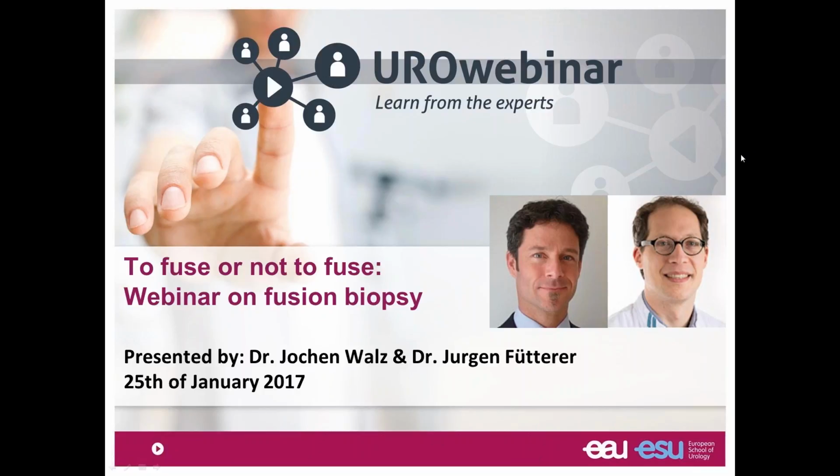And the question, of course, is of special importance and interest for active surveillance, where we might do repeat MRs at a certain time point just to see if lesions that you might see did change over time, and to organize new biopsies. And the question is, do we need to do an MR every year, or do we need to do it every 2 years? And probably every year is a little bit too often, because there will be not too many changes in there. But we do not currently have specific data on sequential MRs where we can really explore this question, how fast prostate cancer might progress in MR images.